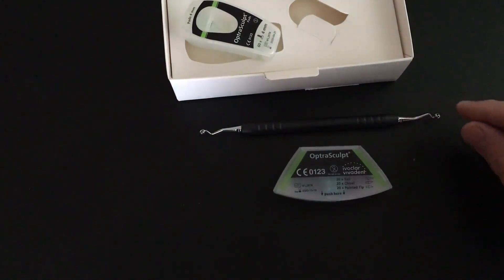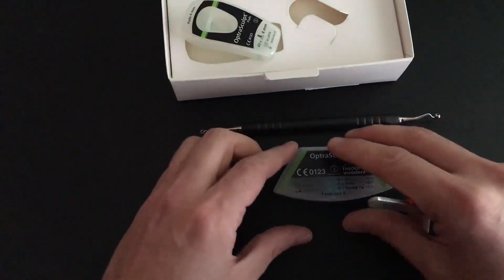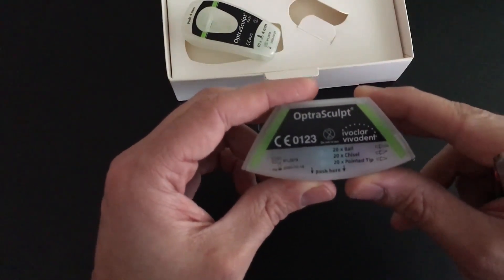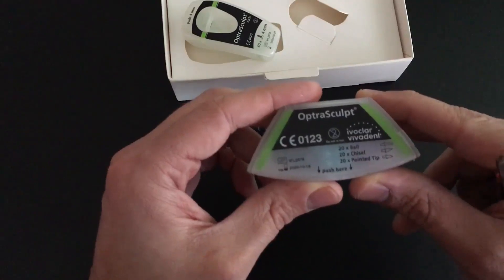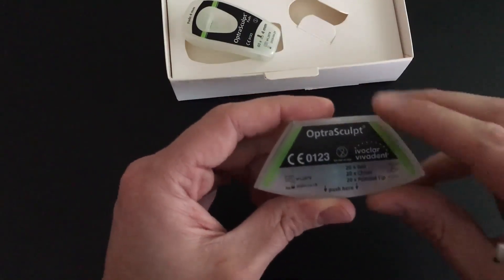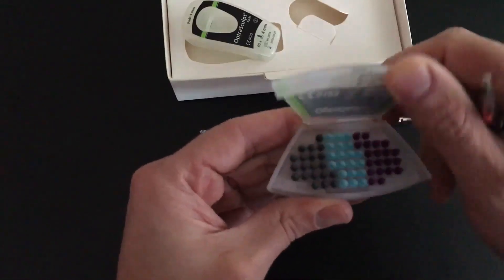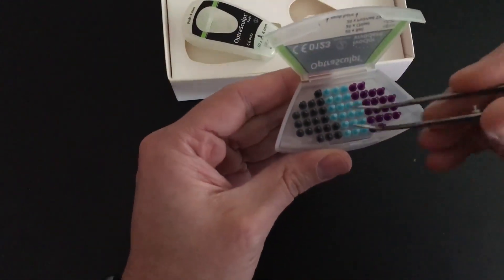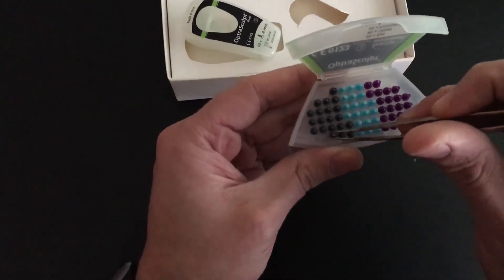IvoClar has come up with these attachments for posterior teeth. There are three different attachments in this one little kit — 20 of each: a ball, a chisel, and a pointed tip. If you open it up, you can see they're color-coded, so you know which one you're getting just by looking at the color.